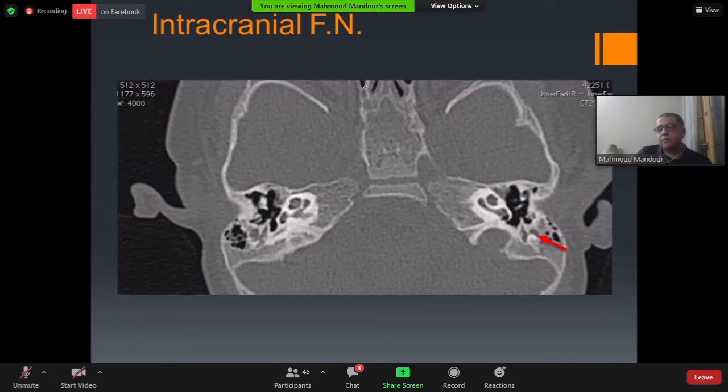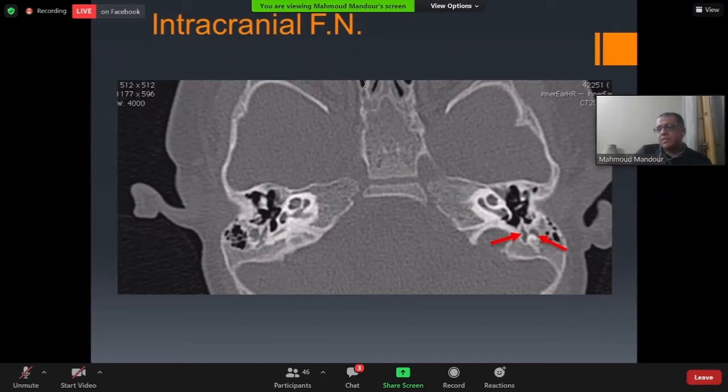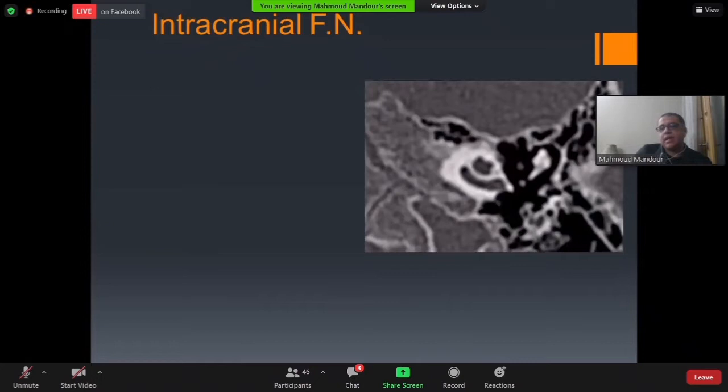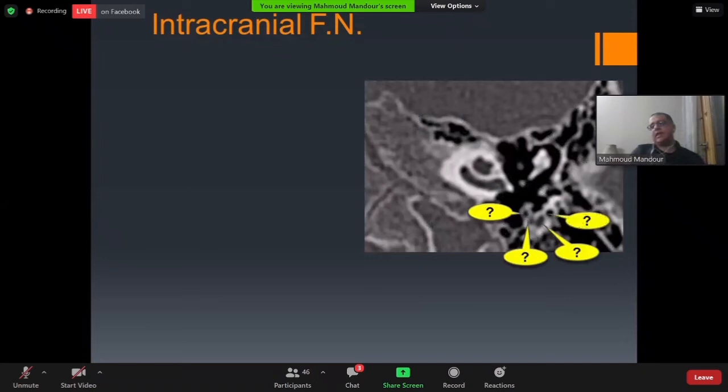In the pyramidal prominence, you typically find two structures: the lateral structure is the facial nerve, and the medial structure is the belly of the stapedial muscle. On a single axial CT cut, it can be a dilemma to determine which structure is the facial nerve and which is not.